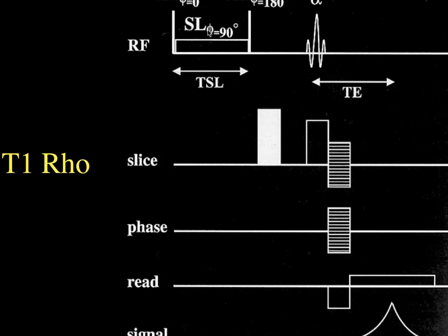It would be a much more efficient pulse than doing dGEMRIC if it worked out. But it's been around a long time now and it hasn't really worked out, so I'm a little suspicious. Yeah, what would your standard be? Like you're saying, the standard would be biochemical analysis, just like it was for dGEMRIC.